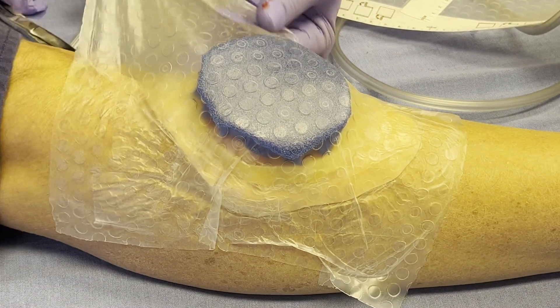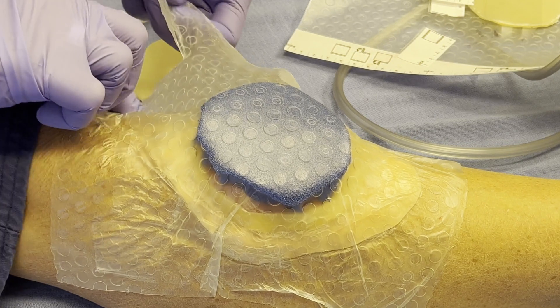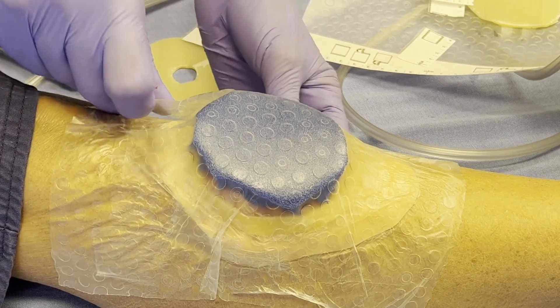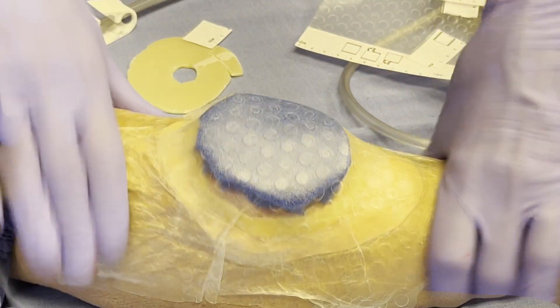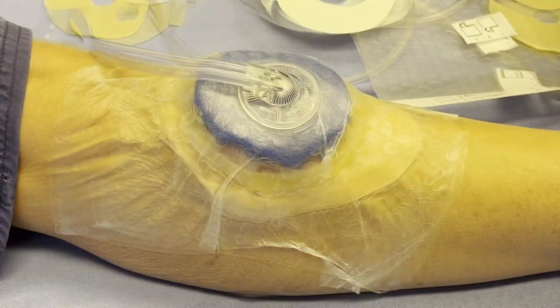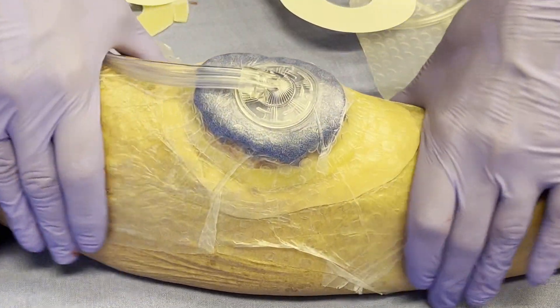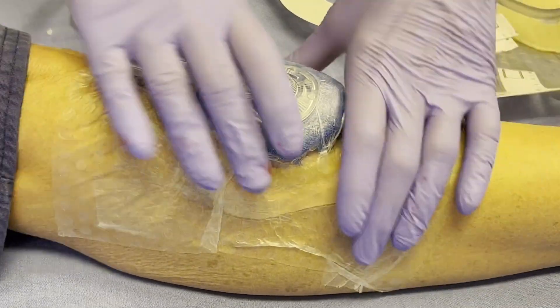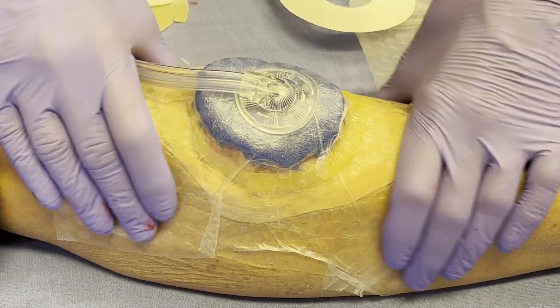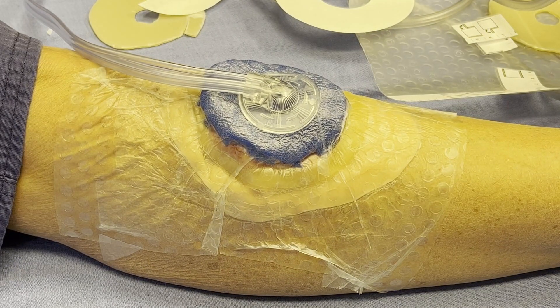It's nice and comfortable for the patient, especially for walkers. If you have a real hard angle, we'll give these a little bit of a trim so we can do what we call the petal technique — pedaling down over the top. I'm going to put the tail upwards so you don't trip. During the drawdown phase, you really want to give your dressing some love, and generally you can get it to draw down pretty easily. Almost every time with Cleanse Choice Complete or Cleanse Choice, you'll hear whistling when the drawdown is happening. That's the beauty of the Cleanse Choice Complete — it's pretty easy.